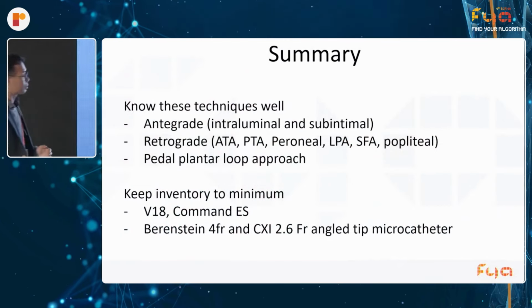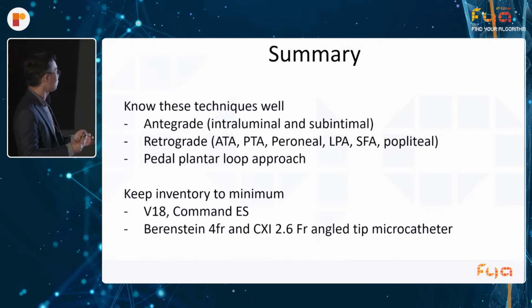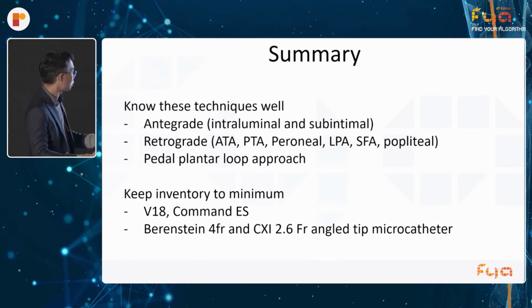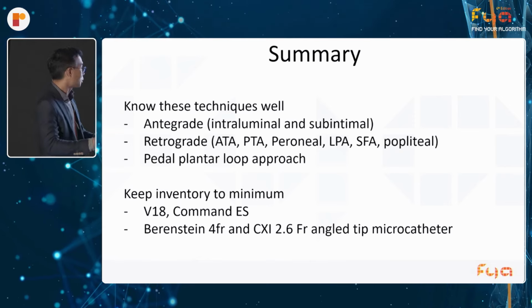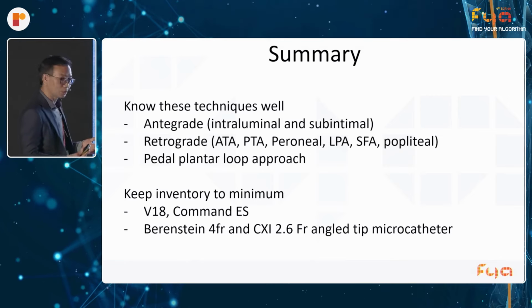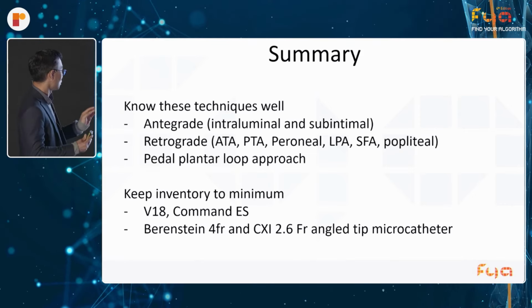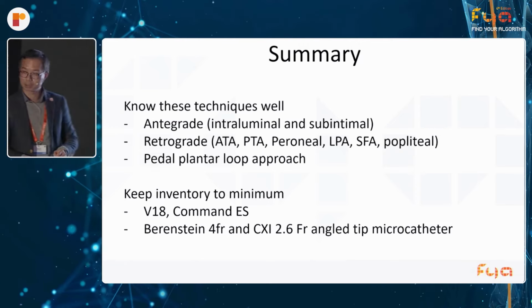So to summarize, if you want to deal with CLTI, then I think personally you need to know these techniques really well. Antegrade, first of all, that's bread and butter. Intraluminal and subintimal. Retrograde, you need to know how to puncture these arteries, in my opinion. And the pedal plantar loop approach. For me, I keep my inventory to a minimum. I use some other CTO wires, but for me, the workhorse wires are V18 and Command ES with workhorse catheters, Bernstein 4 French, and a CXI 2.6 French microcatheter.